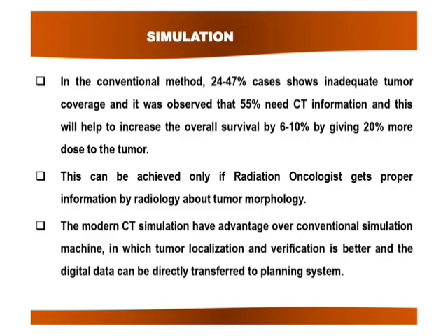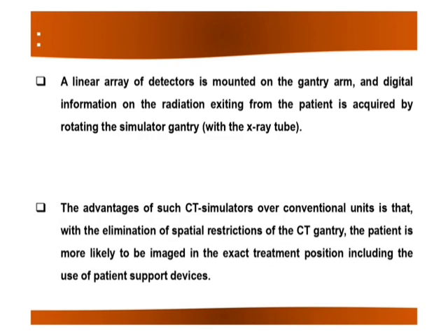Along with that, the patient can be imaged. The major disadvantage is the time needed to image a large number of CT planes and the poor image quality in the conventional CT images. In tomotherapy, the CT is mounted with a therapy system. The CT is mounted on the linear accelerator, so the online treatment plan can be rectified as and when needed.